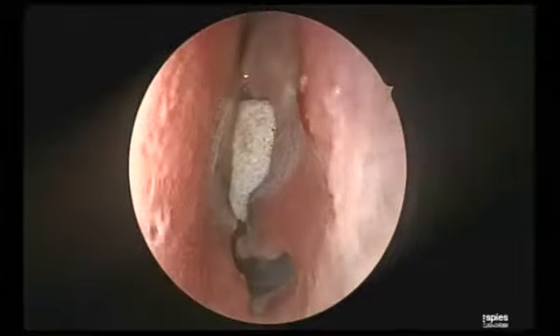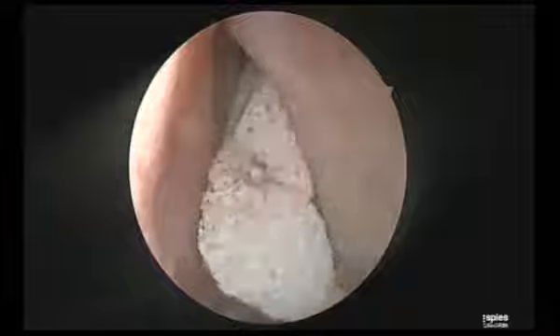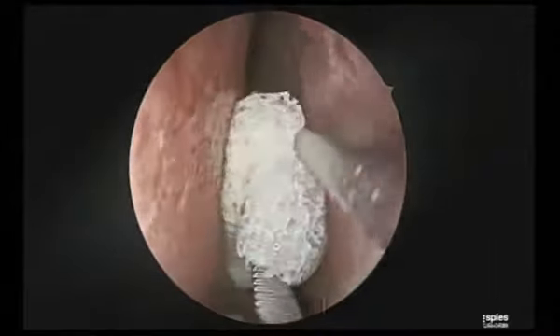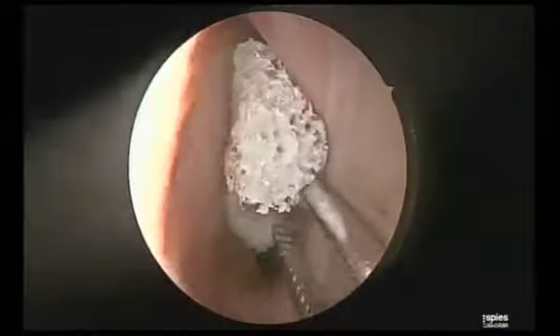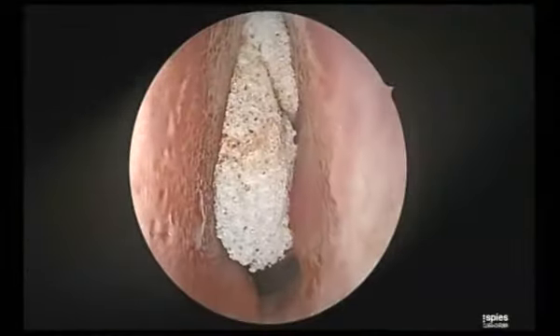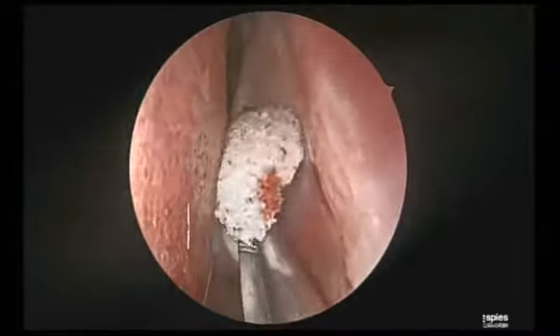Now there's some change that has happened in this. Earlier with Satish, we used to pack that for like 15-20 minutes, maximum packing. All that has changed. Now he just applies it, and he's actually not applying too much pressure with the merocell, as you can see, Ashish.